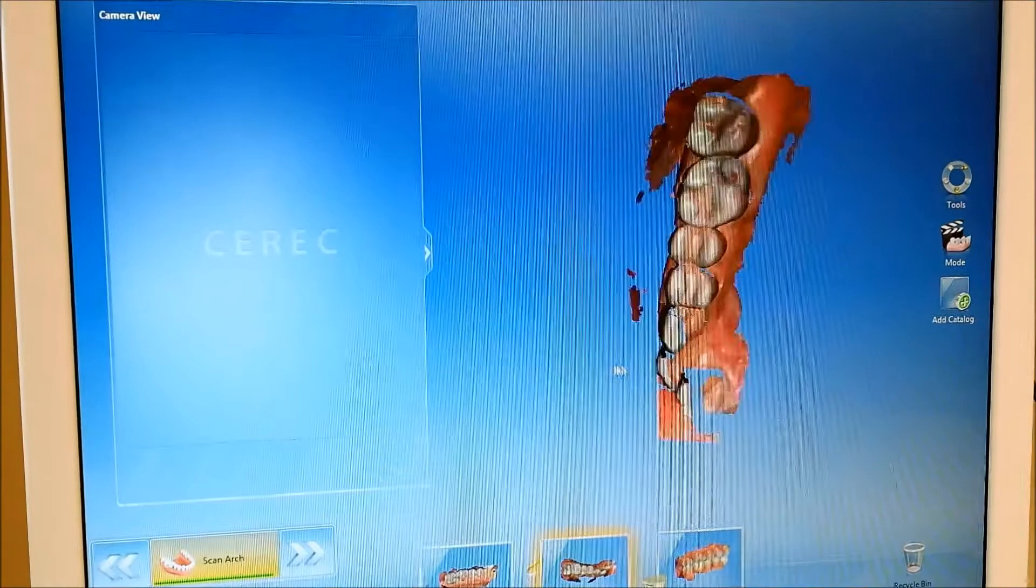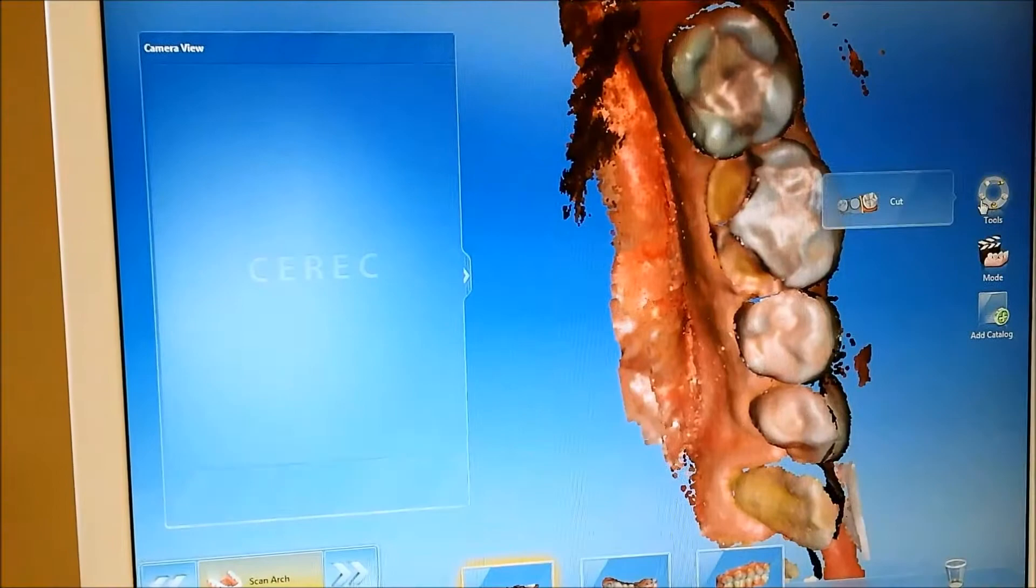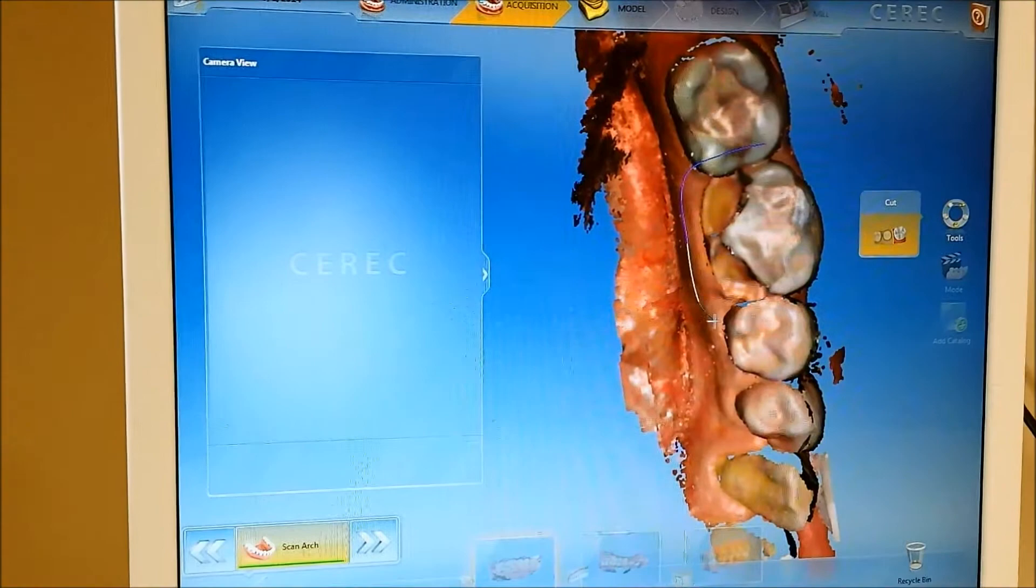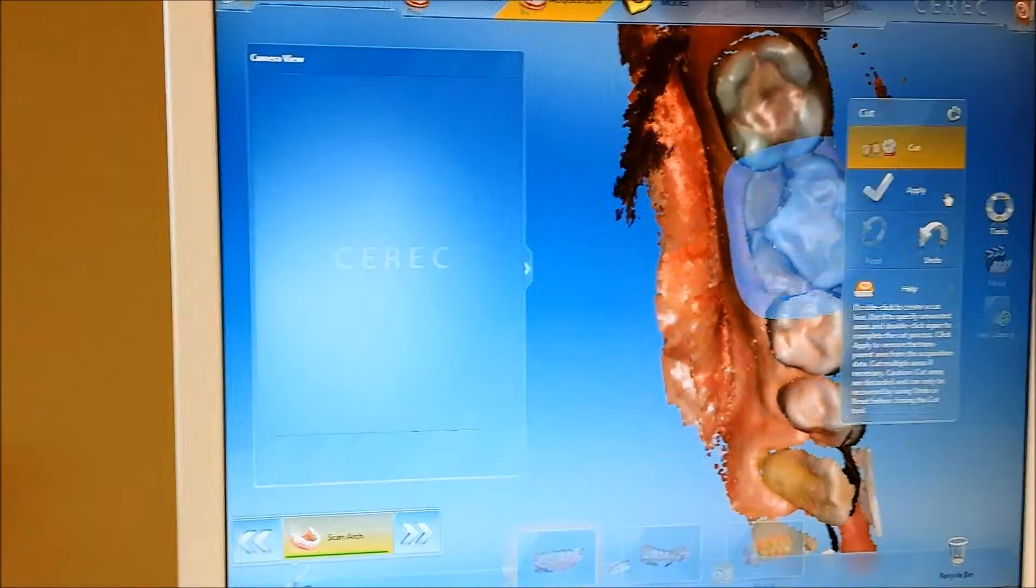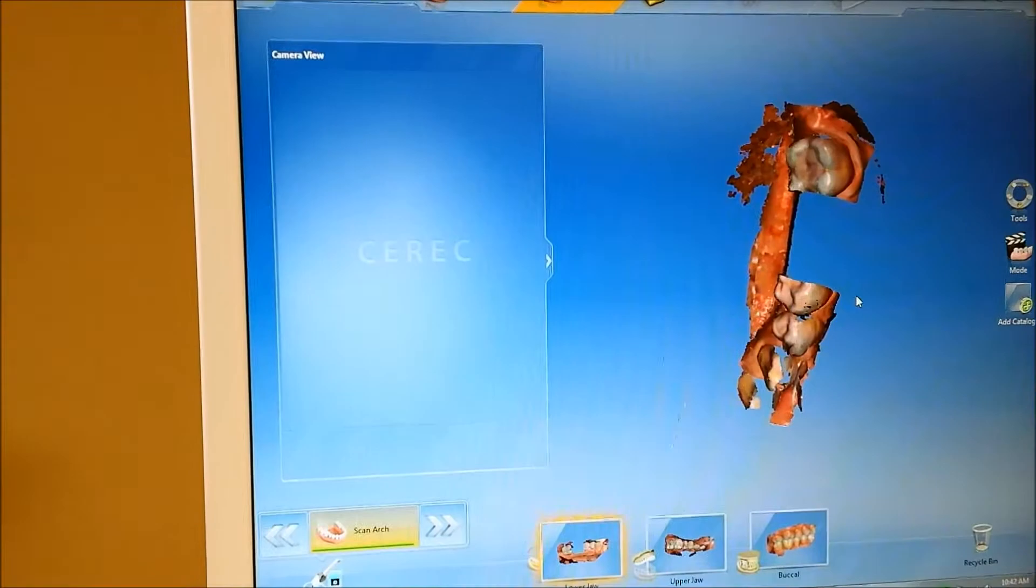That's pretty cool. And then what I'm going to do is I'm going to actually cut and paste this tooth that we're going to replace. So what it does is it'll stitch the scan after we prep the tooth and fill it in with what's new.